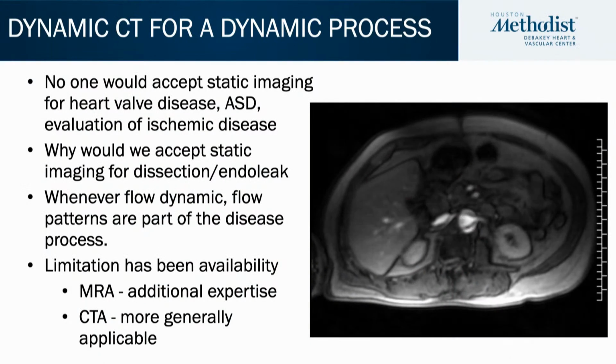And here's an example of a dynamic obstruction in action. The people who made this classification are brilliant. Dynamic versus static obstruction was done without any imaging. It was conceptual. Now we can actually see this pinchcock effect on the renal artery, and one of the reasons that we think this is important.